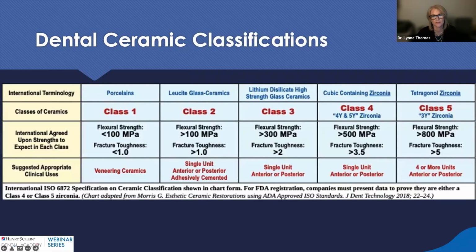So for today, we're going to look at Zirconia Plus. That's the successor to Zirconia, one of the first CEREC blocks of zirconia out there. And we're going to also look at the more translucent or aesthetic zirconia, which is the multi-layered zirconia, MTL. And then we're going to finish up our lecture today with looking at a high strength ceramic called Tessera. That's one of the newest blocks out there for lithium disilicate.